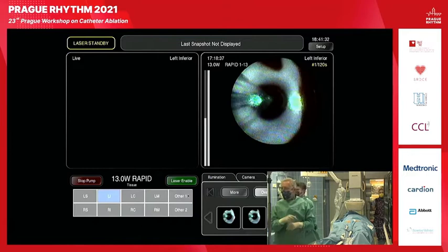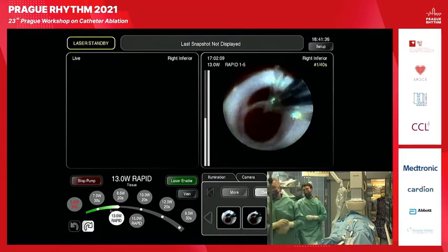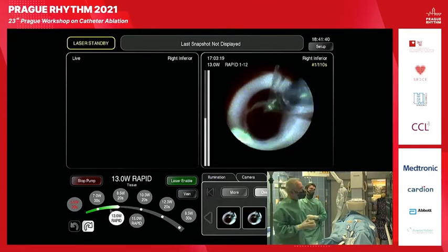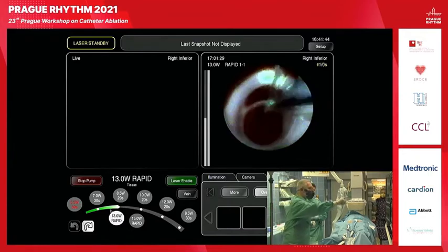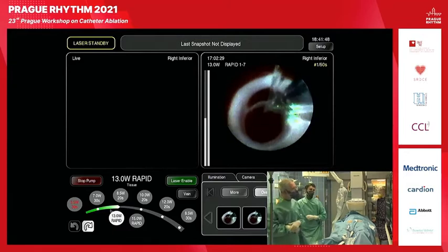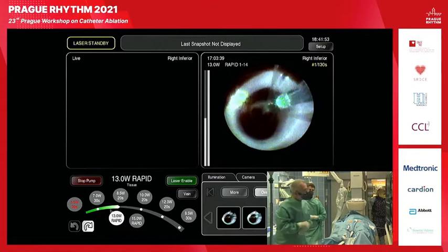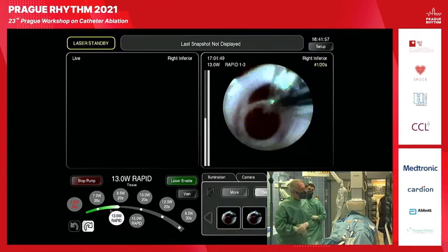So the last vein we did is the right inferior one. You can clearly see the anatomy. When the right inferior vein is branching early, the balloon clearly contains all this circumferential, even plus visualization, all these branches. So you can appreciate the visualization of the anatomy, which I like.